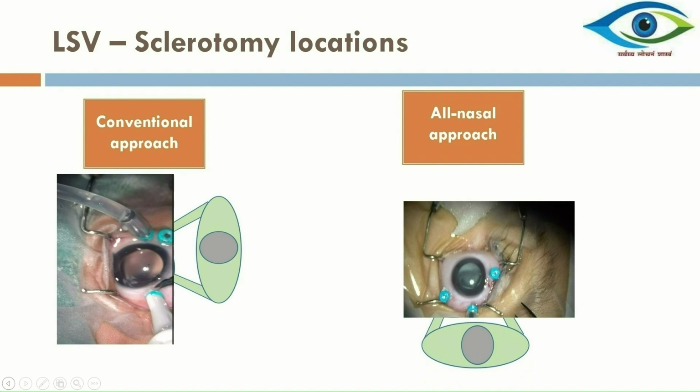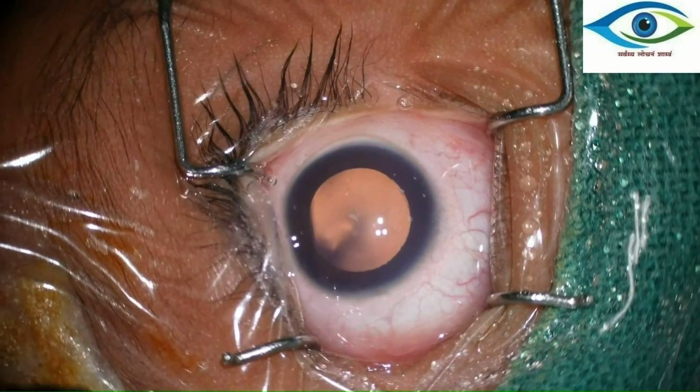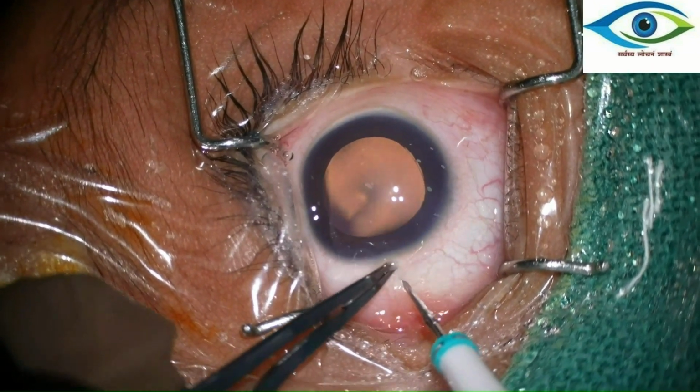Here you can see the actual image showing the position of ports in the conventional as well as the all-nasal approach. In the latter, the infusion is connected to the middle port. This clip shows placement of 3 ports in the all-nasal approach using the combined technique of modified trocar cannula entry.